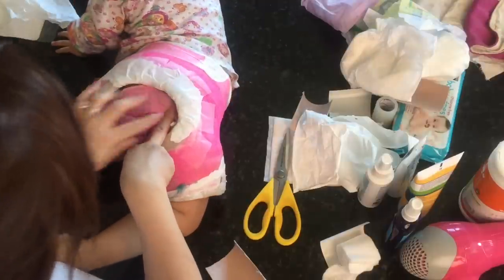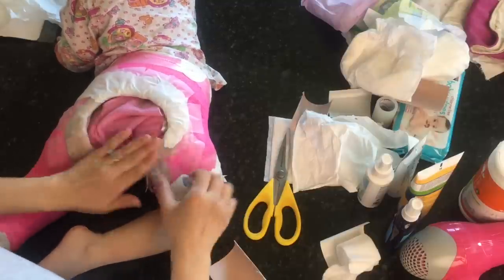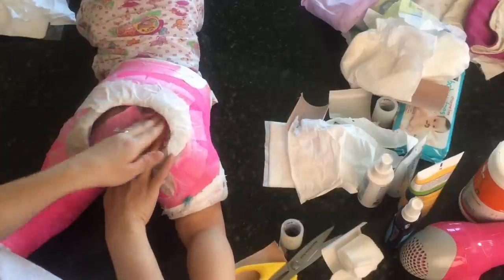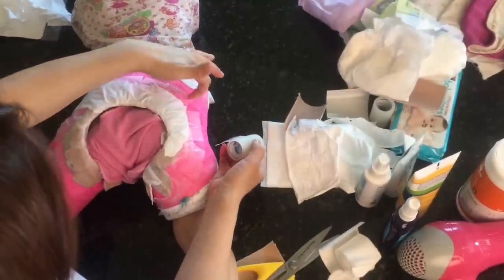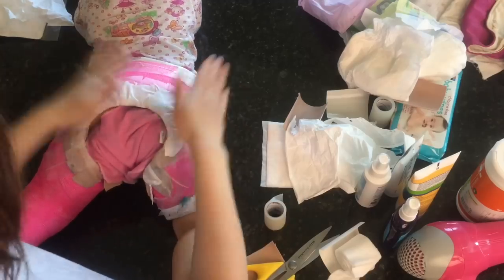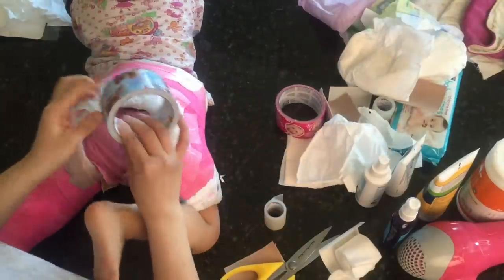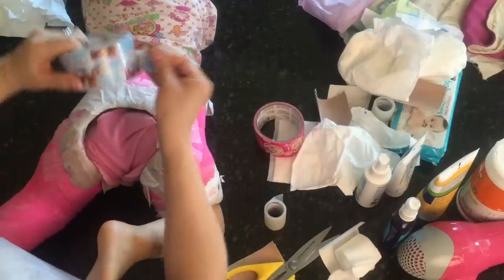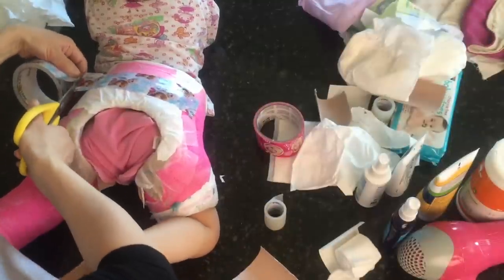See how it's sealed out and sealed in. I didn't have enough of the hospital tape in the very beginning — it kept coming off. So I went to a school supply store and got duct tape. For girls you can get pretty designs, for boys there's Lego or other styles. You put the tape around to seal it off, and it actually makes the cast fun. This was a lifesaver.